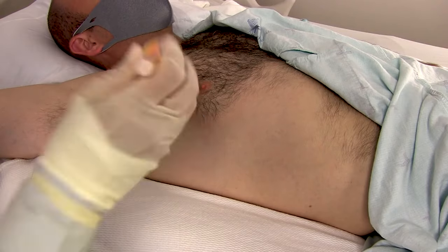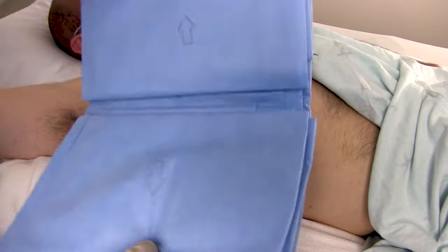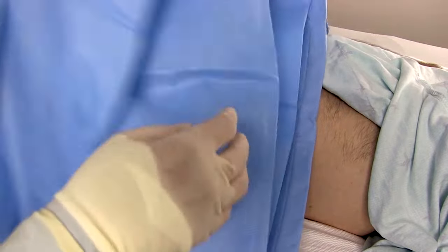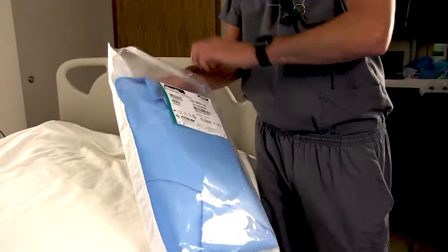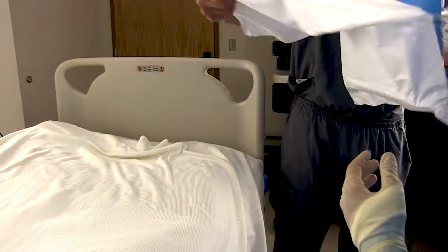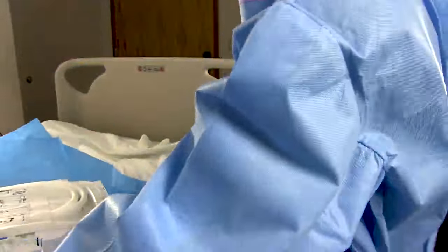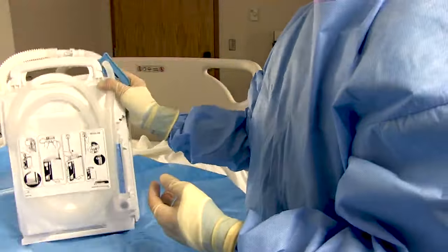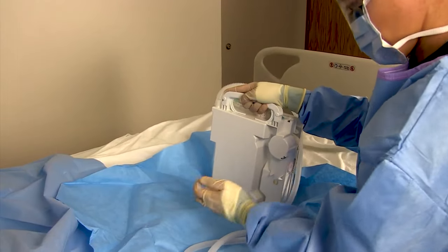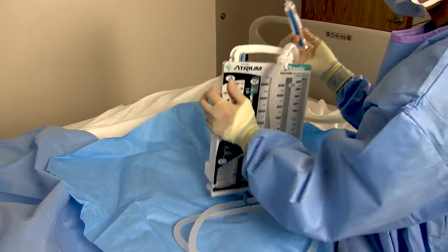All sterile. Unless you're in a crash situation, go ahead and start prepping and draping the field, keeping in mind where your landmark is going to be. For demonstration purposes, I'm putting the thyroid drape on upside down on purpose to show that if you don't have a lot of drape at the foot of the bed, you can use the water seal suction canister's sterile sheeting to give you some extra sterile field. I like to open the atrium sterilely at the very beginning so it's easier to hook everything up when done. One really important thing: fill the water seal chamber with the layer of water it needs to actually work — in the atrium, take out the little tube of water on the back and squeeze it into the blue nozzle.